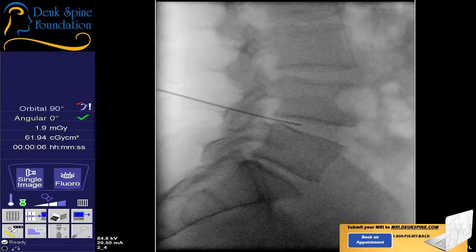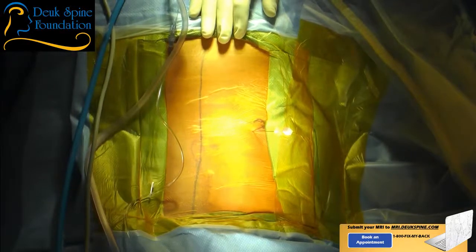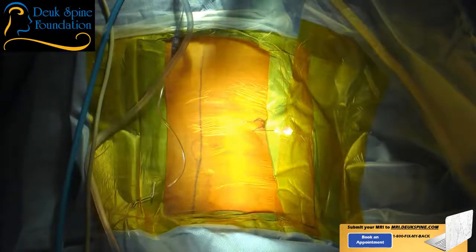They say it's better to be lucky than good — we got it on the first try. For aspiring surgeons watching this video: the patient is awake so we can make sure we're not hitting the nerve root. If I hit the nerve root, he would say 'ouch' with pain or electricity going down his leg. He didn't have any of that, so I know I went past the nerve root perfectly.